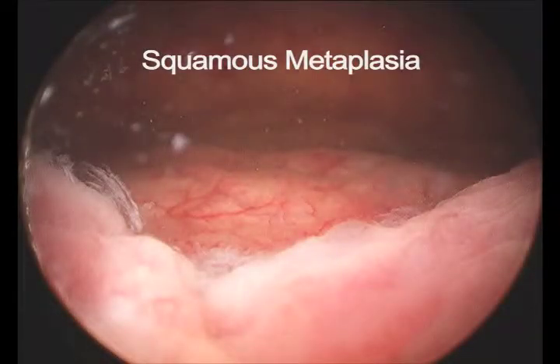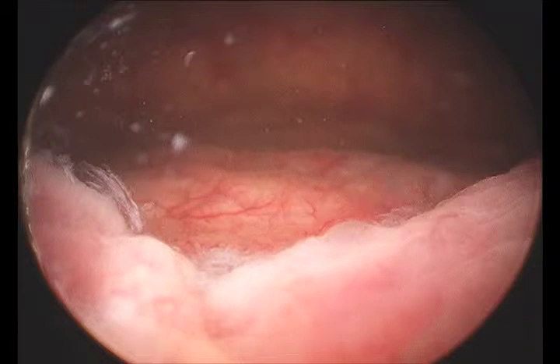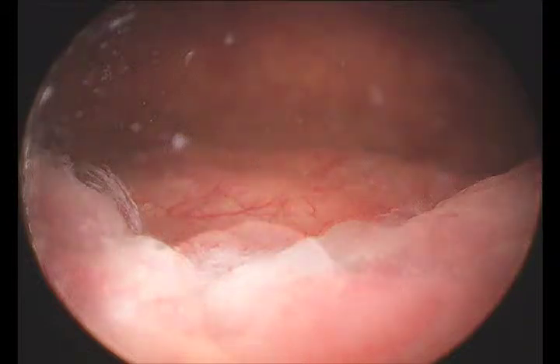Squamous metaplasia is a common finding which is often located within the trigone itself. This is an overgrowth of the cells that make up the trigone.